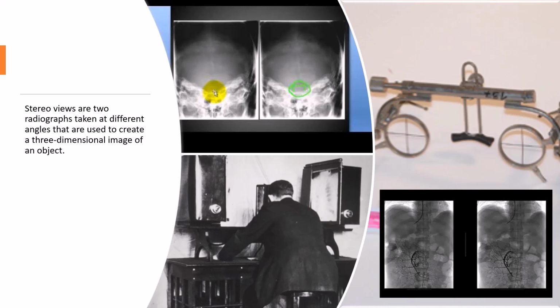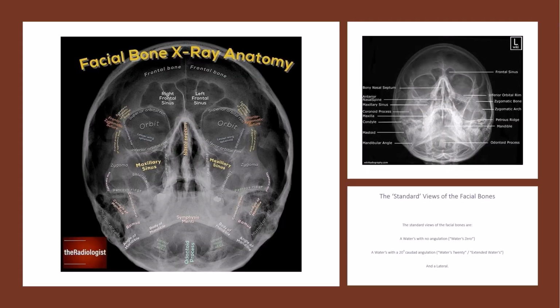Oh well, it takes a little practice and I'm sure you'll get used to it, but let's take an easier look at this. Here we see a 3D view of a stereo Waters and you can see the anatomy very well. This probably dates me, but when I was working my way through college, I was working ER at night and I did a lot of stereo views for facial bones and gunshot wounds.